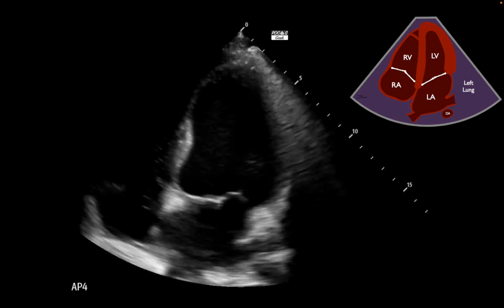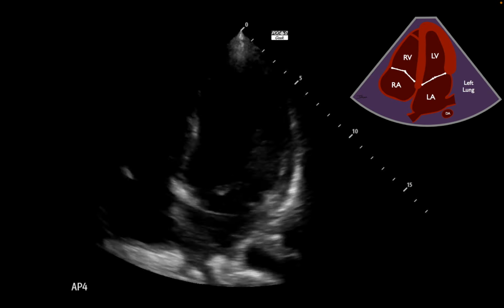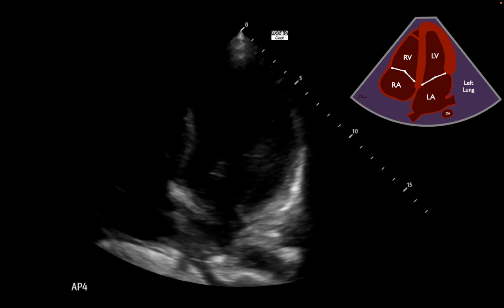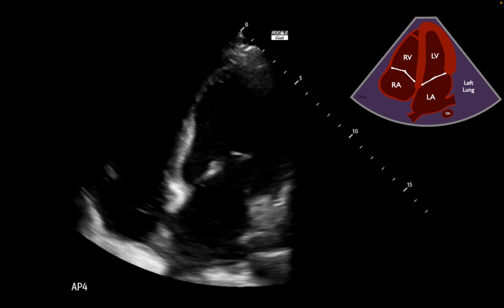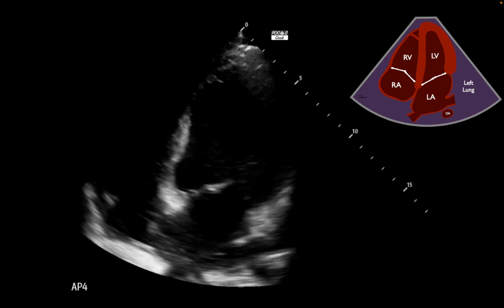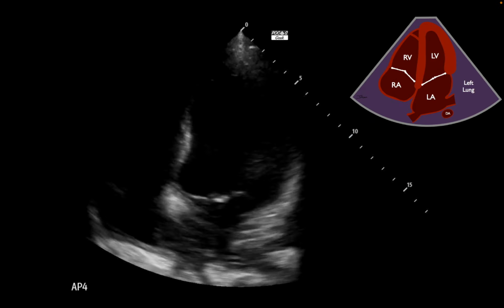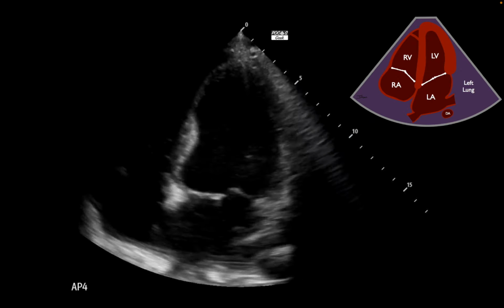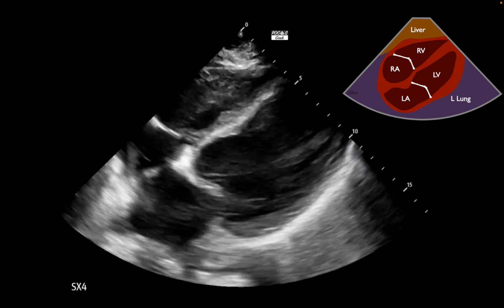Again, this may allow you to see that aortic valve insufficiency just a little bit more. You could throw color Doppler over that and really appreciate the regurgitation. That would be red flow coming back to you from that aortic valve and may key you in further on what's going on if you could recognize that abnormality in the other views. We go on to the subxiphoid view.